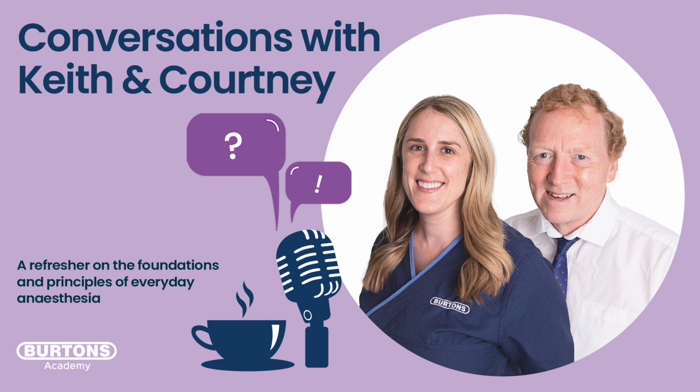With pressure cycling, you're still putting in a constant flow. This is still a flow controlled or volume controlled ventilator. Constant flow, but we end inspiration by reaching a certain pressure. In those instances, we don't know the inspiratory time, because we don't know how the patient's chest is going to behave. In other words, we don't know anything about the patient's compliance, and the ventilator knows nothing about it either.